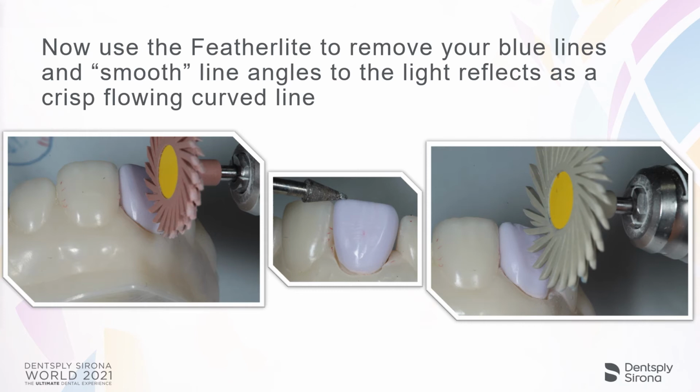But in this instance, what you can see here is the patient does have a couple little incisal edge chips. Well, how do I create those? Well, you can use a diamond disc at a very, very slow RPM. You're talking 2,000, 3,000 RPMs maximum. Or you can use a pointed cone like we have here. This is a Brasseler sintered diamond. But overall, this can start to create some of that really fine anatomy or some of those scratches that you might start to see appear on the adjacent teeth.